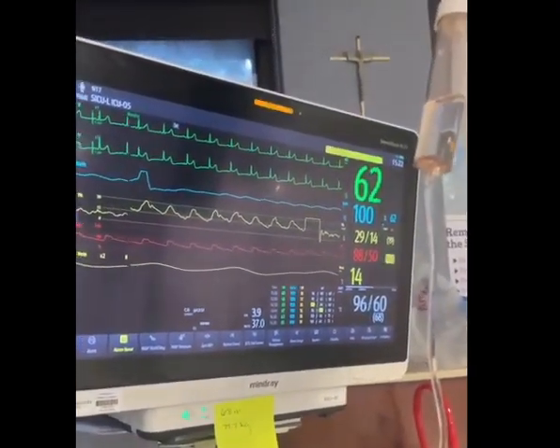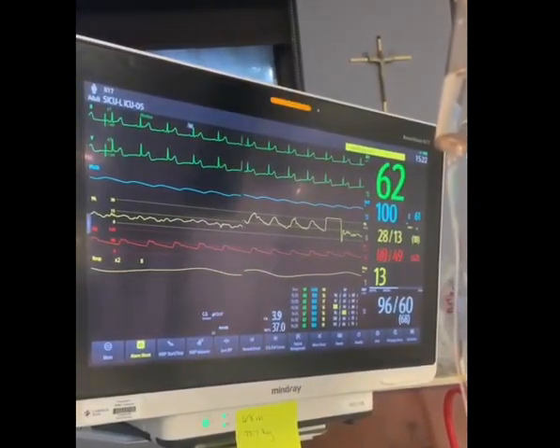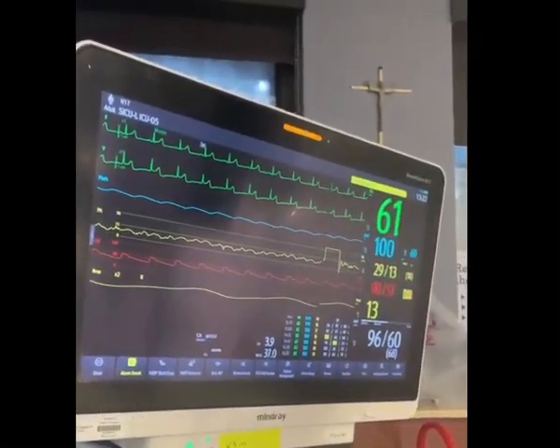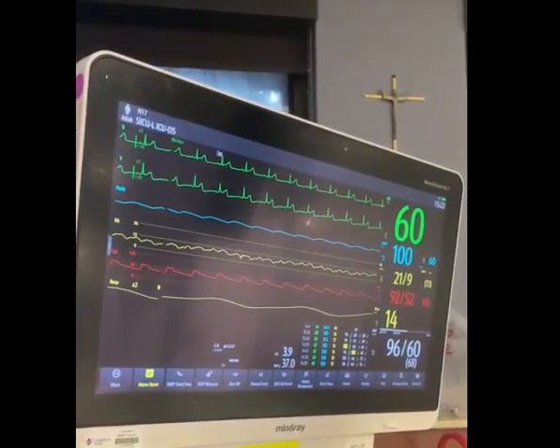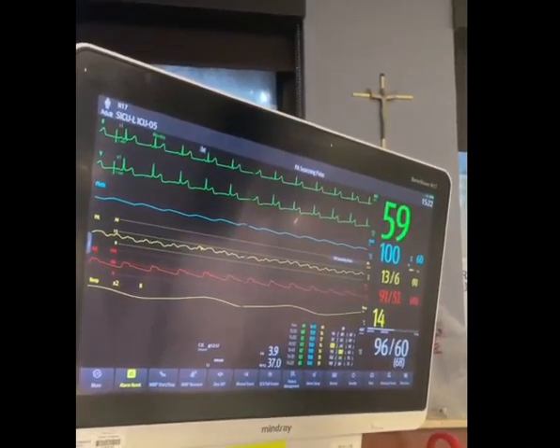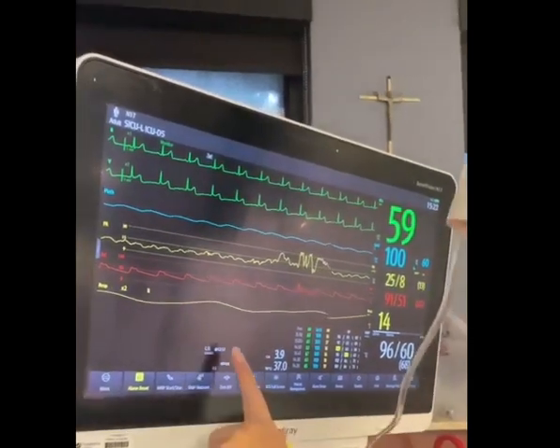Okay. So when I start, I'm turning my stopcocks and I'm getting the CVP right now, so you can see the waveform going from a PA waveform to a right atrium waveform. So now I'm waiting for the waveform to kind of line out and give me an accurate reading. My CVP, okay. So you can tell over there in the parentheses it says about 8 and 9. That's the value you're going to take.